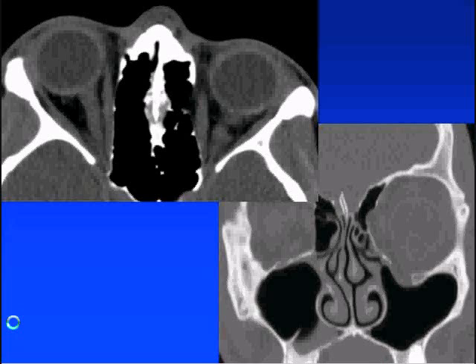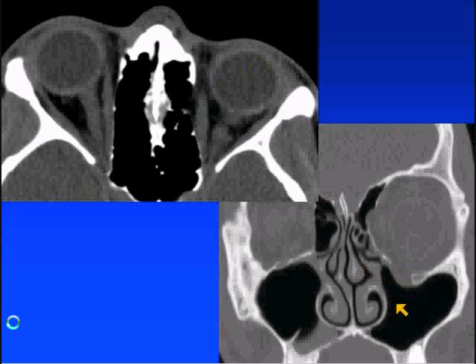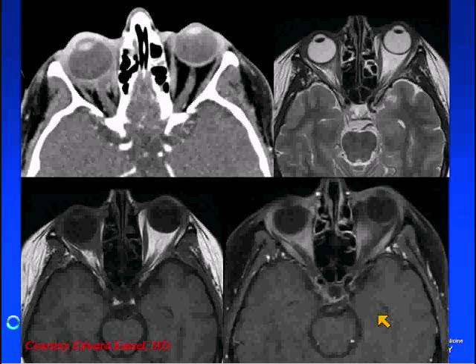This is another patient with enophthalmos. When we look at our soft tissue windows, the key is looking at our bony windows from the coronal image where we can see a defect within the orbital floor. This is enophthalmos secondary to an orbital floor fracture.